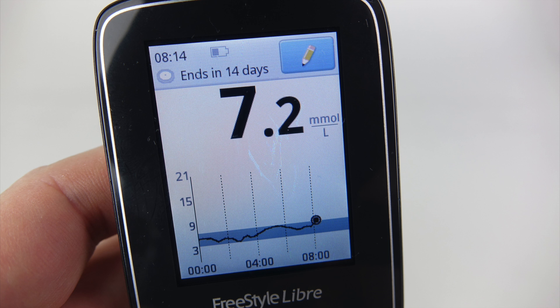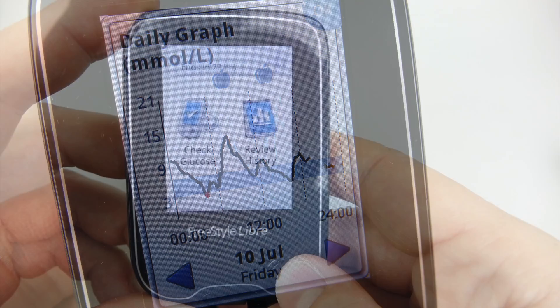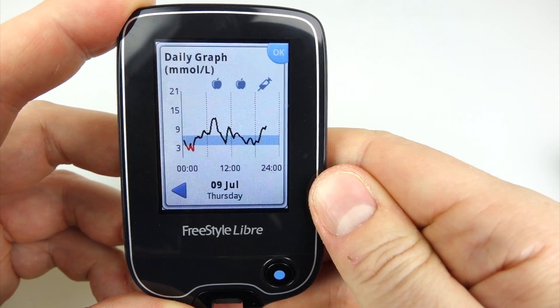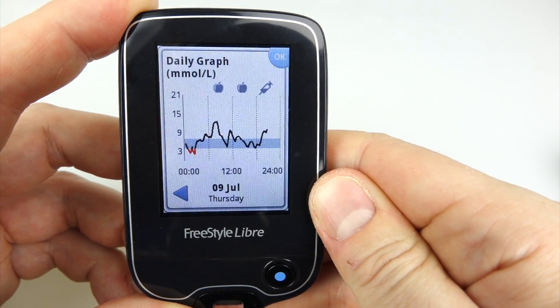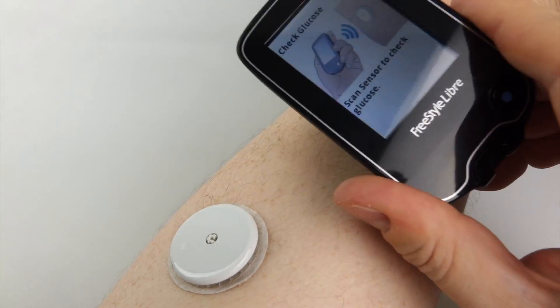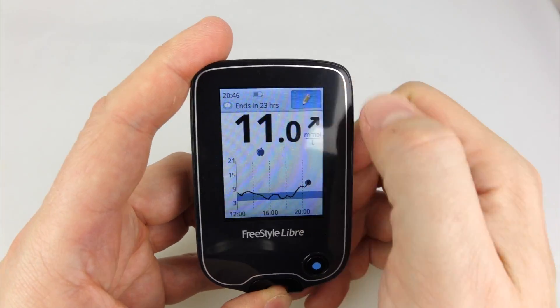Unlike a normal blood glucose monitor, the sensor itself can remember eight hours' worth of information, and when you scan it with the reader, the reader pulls that across and adds it to its own storage — which can hold up to 90 days. So you get up in the morning, do a scan, and it'll tell you what was happening while you were asleep — information I didn't have before. In fact, I've got some worrying data showing I'm dropping really low sometime after midnight, and if you get too low you could go into a coma, and I'm sleeping right through that.